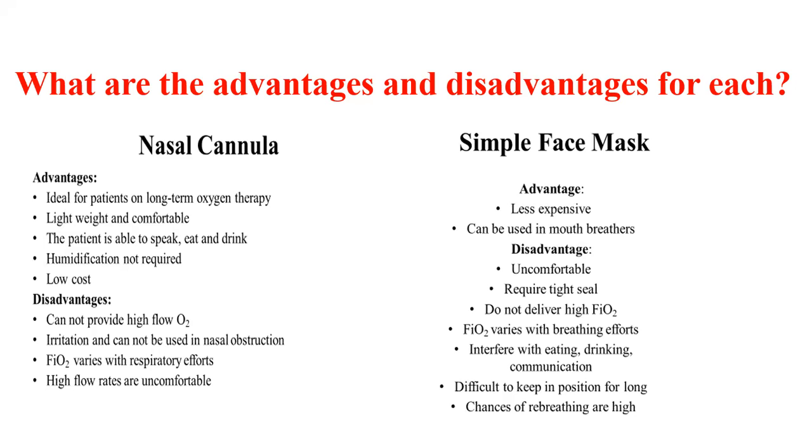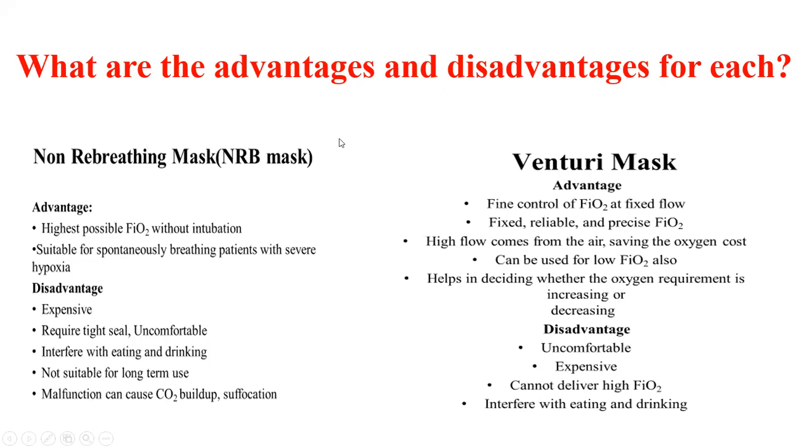Also, it delivers a limited oxygen flow and FiO2. It also requires a tight seal so that all the oxygen goes immediately to the patient. Next slide, to see the advantages and disadvantages of the mask with reservoir, or non-rebreather mask.